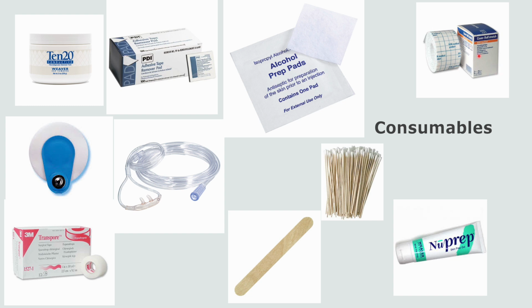A lot of other labs use this really cheap paper tape. One of the reasons I like this tape is because you can use this stuff here. It's adhesive remover, and it gets absorbed by this gauze-like tape. It stretches, this tape does, and when it gets absorbed, that makes it come off super easy. Paper tape doesn't do that. It doesn't get through very well.